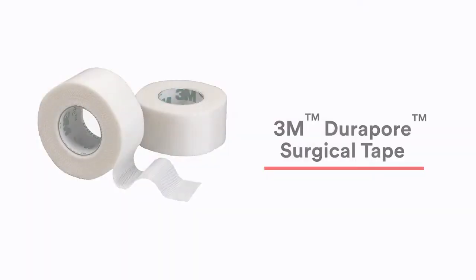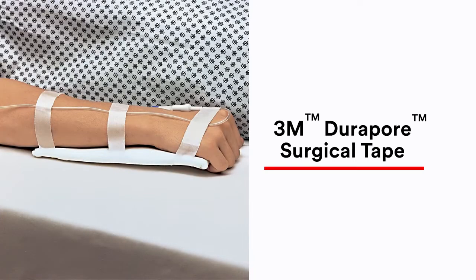Can you give us some examples of when acrylate tapes are ideally suited? Sure. Due to the fact that adhesion properties can be customized and finely tuned when combined with unique backing materials, acrylate tapes are suitable for most medical applications. For instance, 3M Durapore tape is a silk-like cloth tape with strong adhesion that adheres well to dry skin. This is a great option for securing bulky dressings, heavier tubing, or small splints.